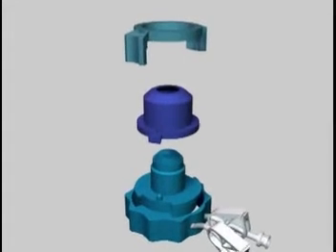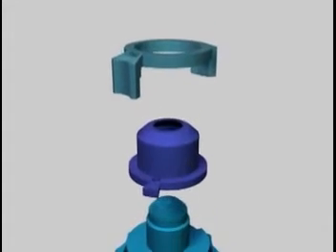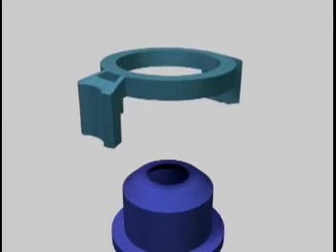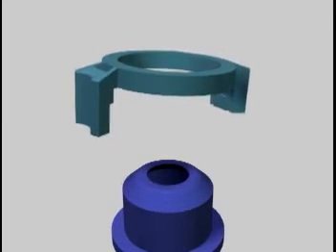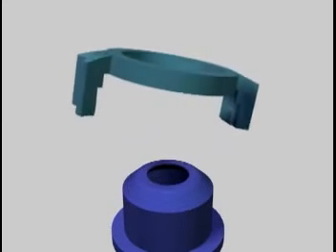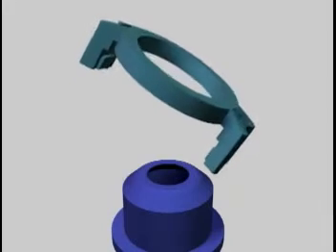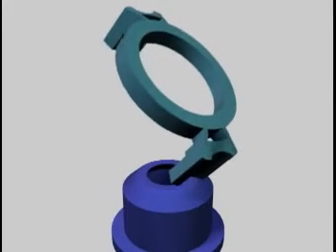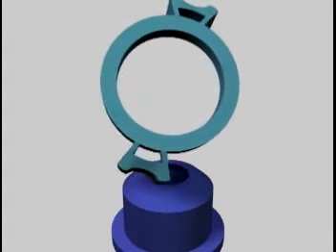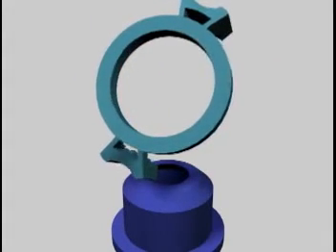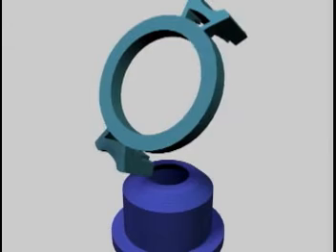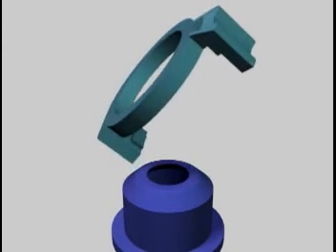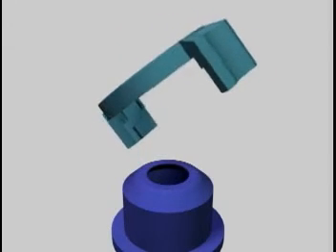The Locking Ring: This device component locks both the tissue and the entire device into place to allow for predictable handling and cutting of the tissue. The ring is rotated into place in a clockwise motion.